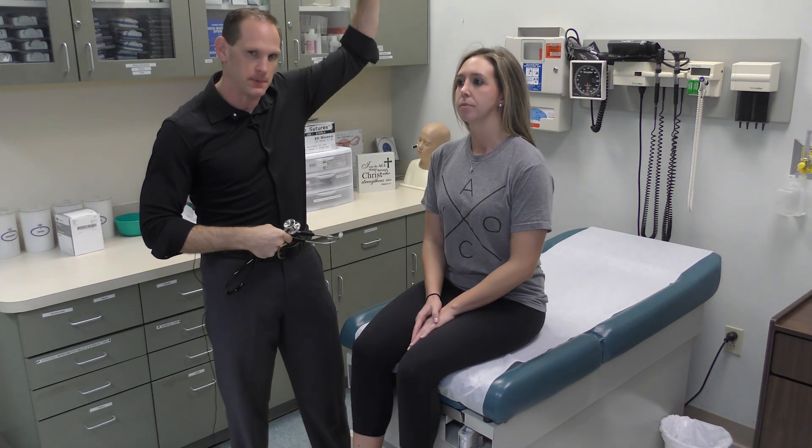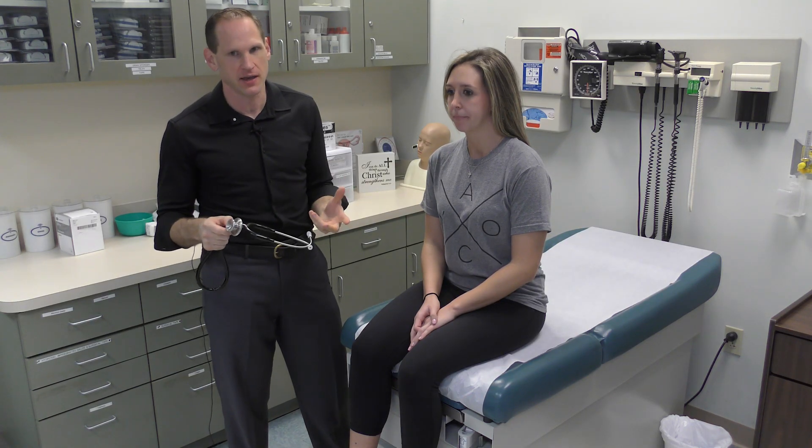Sometimes you'll have to have the patient lift their own breast, or maybe raise their arm up in the air — both techniques get the breast tissue out of the way. Even on a man you don't want to place it straight in; you want to go under and scoop upwards. If you're not hearing anything, chances are you're not in the right spot — you might be too low, on the bra, or listening to the breast tissue instead of underneath it. Take all those things into account when auscultating.